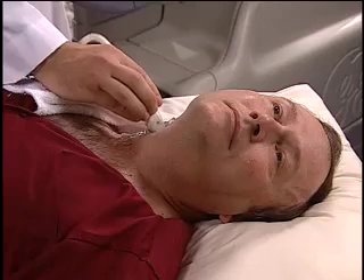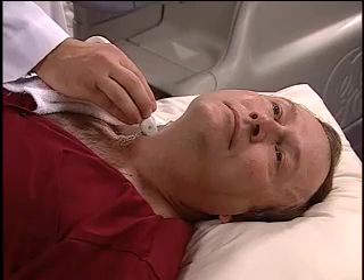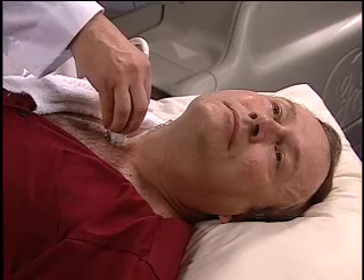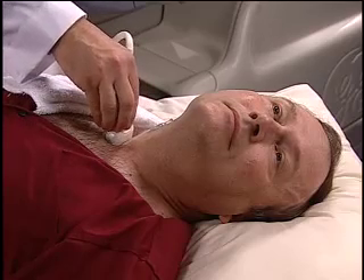So let's have a look. For this exam, the patient will be lying in the supine position with their head and neck placed in a manner that allows the sonographer maximum access to the vessels being examined. In some instances, due to the immobility of the patient, the sonographer may elect to examine the patient sitting in a chair. The patient assessment must be completed before the examination is performed.